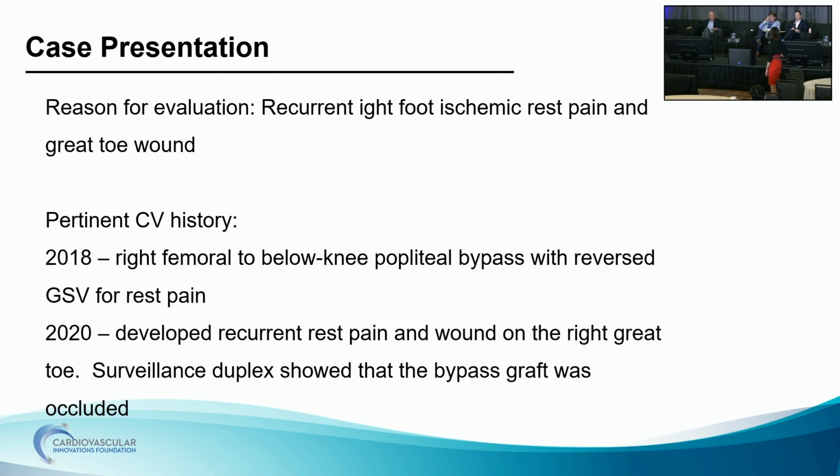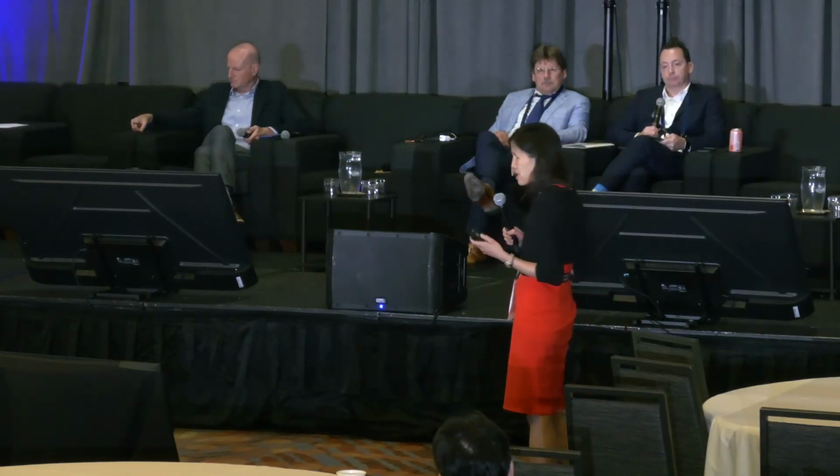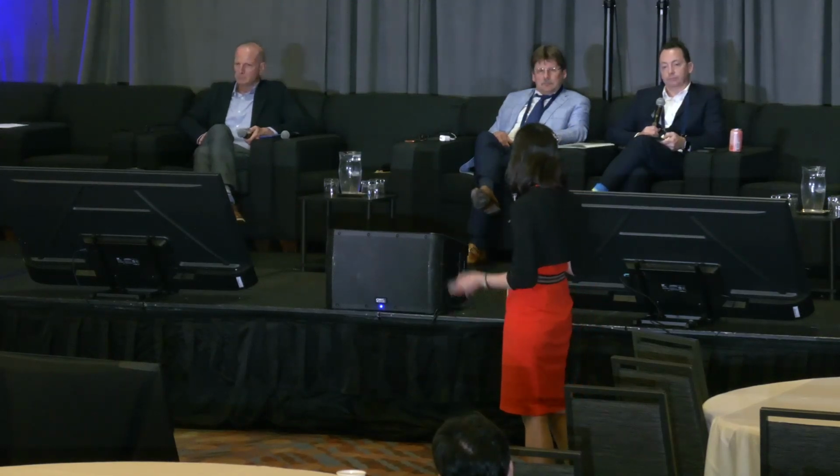Of course, we're like, well, we don't want to put a cutting balloon there, we don't want to cut the suture. Is that a real scare? No, I've actually done it. I use the AngioSculpt, but people do cutting balloon there. I think you can't do it immediately after, though. You have to wait. There has to be some time. I can't tell you exactly how long it can be, but if this is a couple years out, people do undersized, very much undersized cutting balloon.